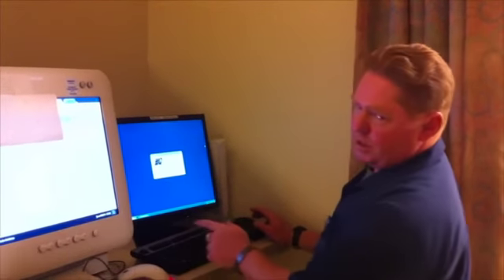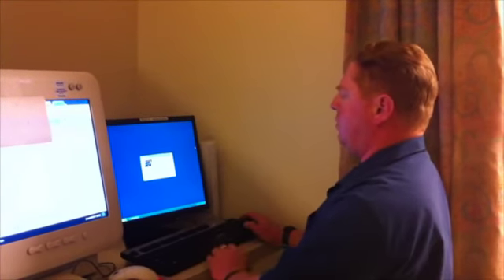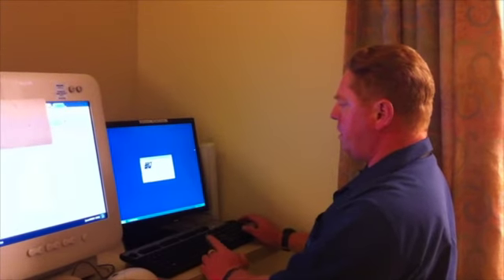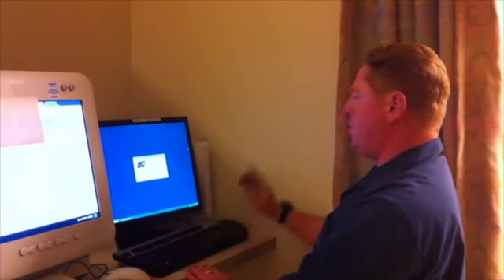I make sure for my chest X-ray, there's an up arrow on both the PA and lateral, and then go in the notes, put in the text initials, my name, and then hit complete.